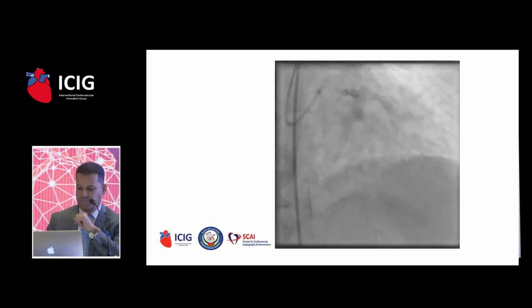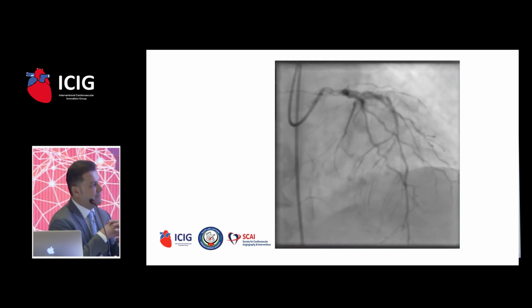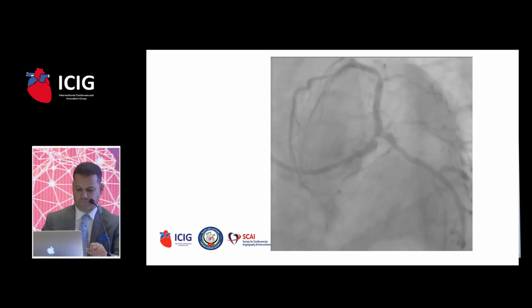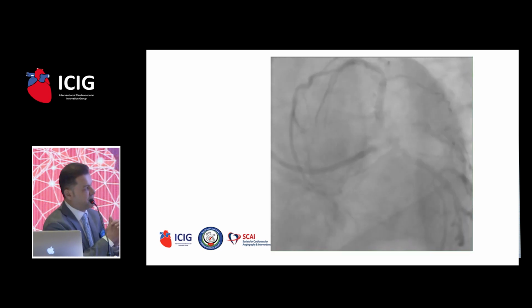This is another view. We can see that the mid-LAD is also diseased. The LCX is not so bad, however the ostium of the LCX is diseased. And this is the spider view. We can see how tight the left main is.